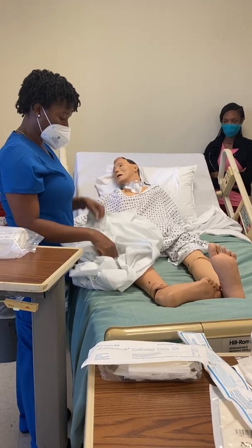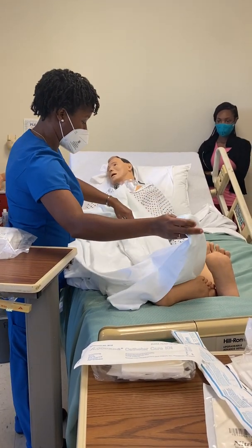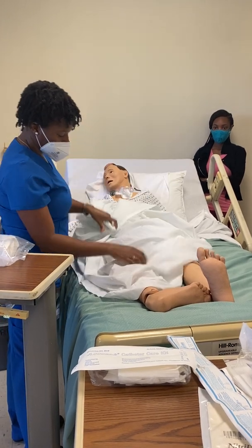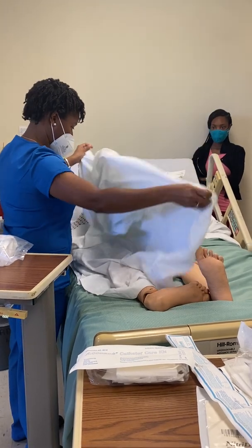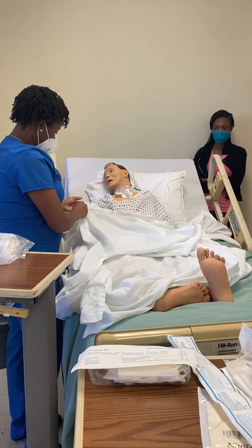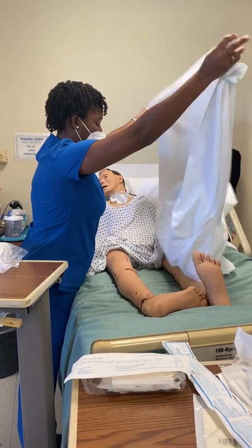Okay? Alrighty. And then once you do it like that, it's almost like making a draw sheet, but you're trying to get to a triangle. I guess you see now why I don't care to use a drape. It's too much to try to make it. Okay. So you make it like a triangle, and what we're gonna do is wrap it around the leg and things like that, okay? So we got it made.